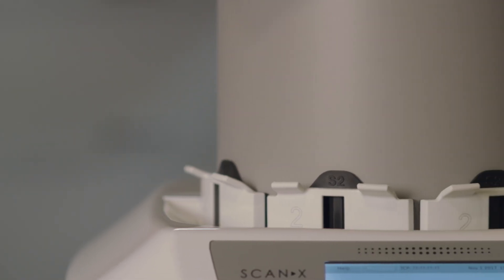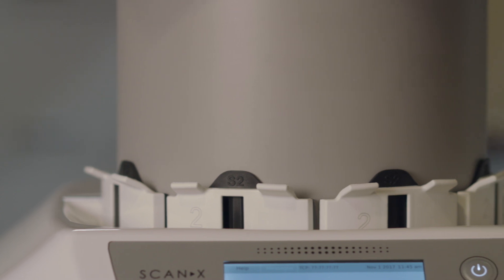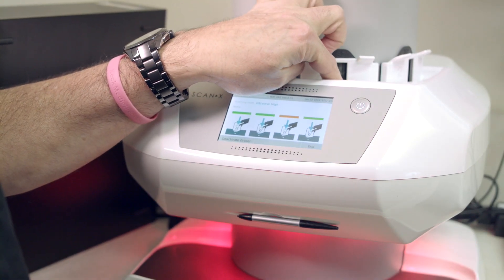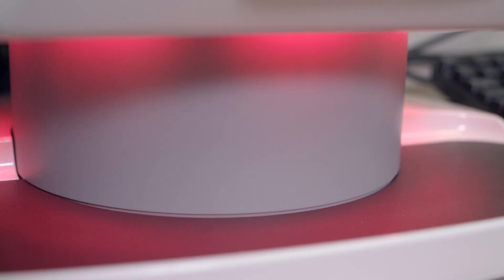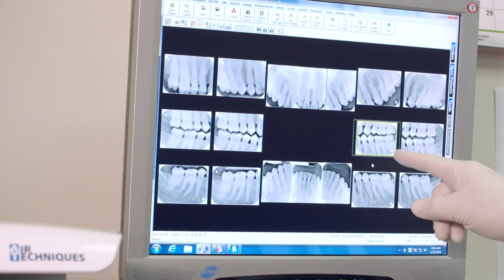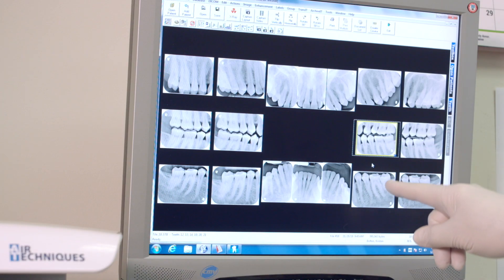The four-track system allows four plates to be processed at the same time, so a full-mouth series of 18 to 20 plates can be completed in under two minutes, making it extremely efficient as compared to other technologies. The Scanex manager allows multiple users to send jobs simultaneously and then select the order in which the cases will be processed.